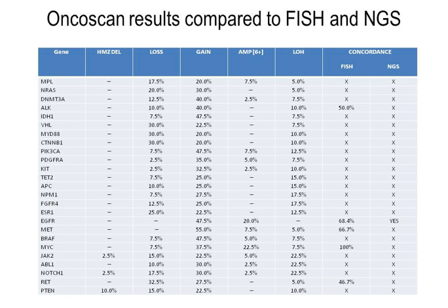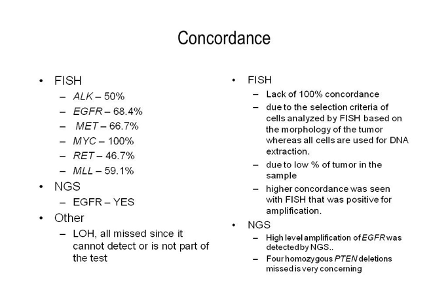So what I'm presenting here is early analysis. I don't want to go through this whole list of all the 50 genes we have, but you can clearly see here, this is the OncoScan data, and we show the concordance between FISH and NGS here. So there are lots of these additional losses and gains which we have seen in our tumors, which were not detected by both NGS and FISH.